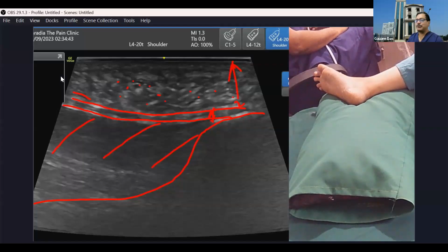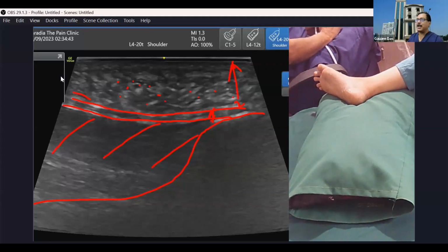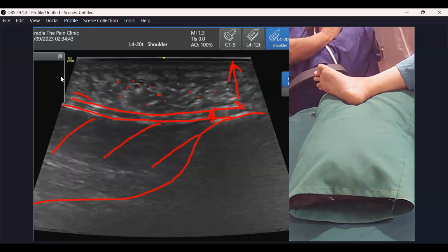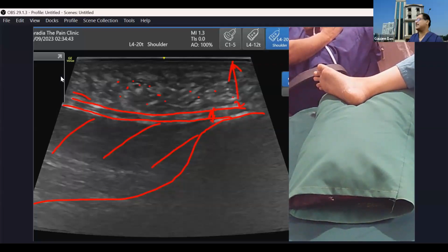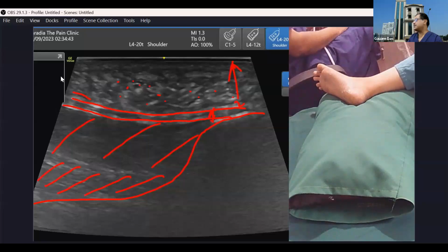We discussed the 3 muscles. On the medial side, abductor hallucis. On the lateral side, abductor digiti minimi. And in the middle, what was there? Flexor digitorum brevis. So this muscle is flexor digitorum brevis. And there is another muscle there. What is that below it? Quadratus plantae. Okay, understood?